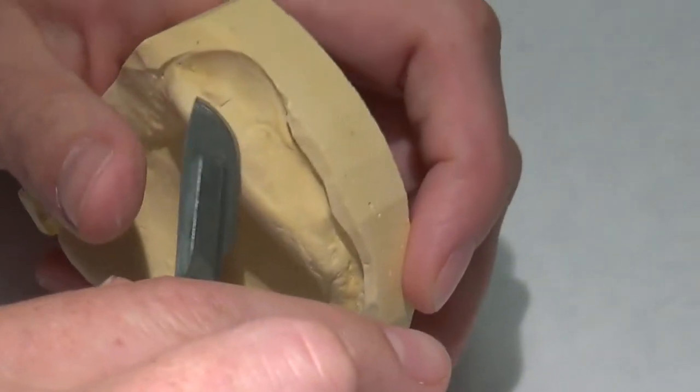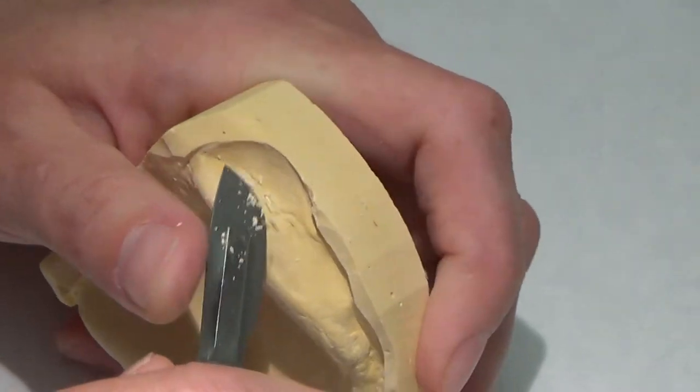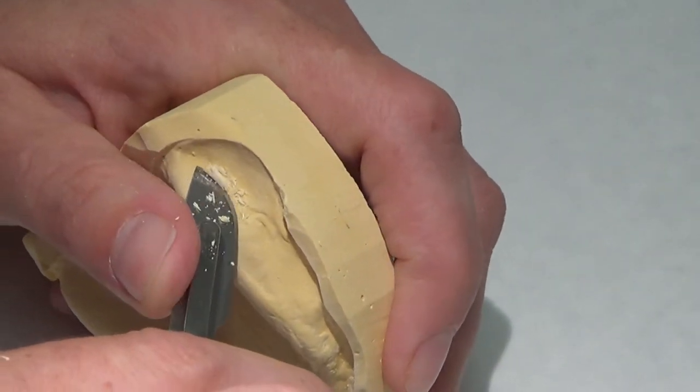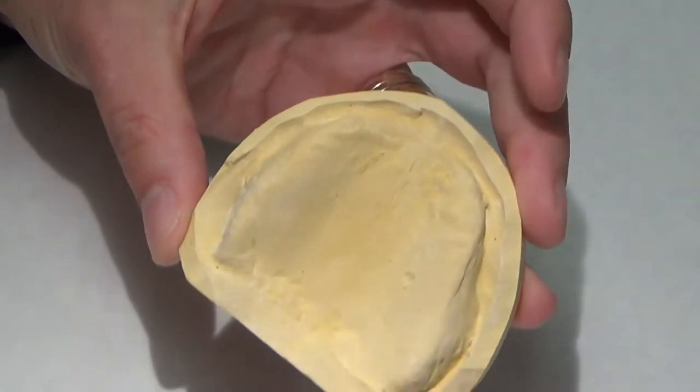I'm going to just take it off. It's a little bit of an arbitrary area but my block out should take care of it. I just don't want my tray rocking around it.